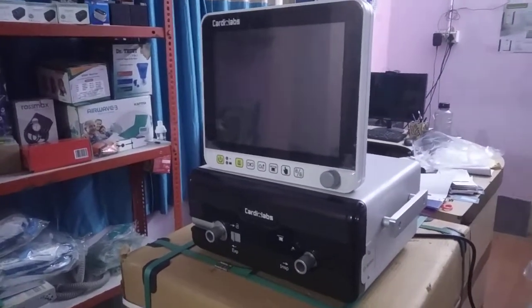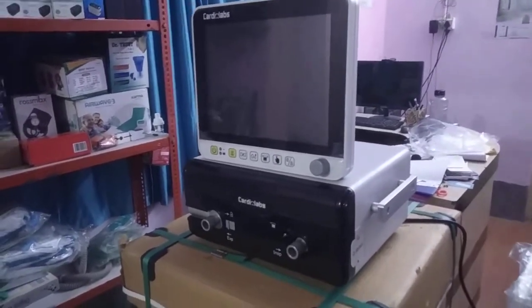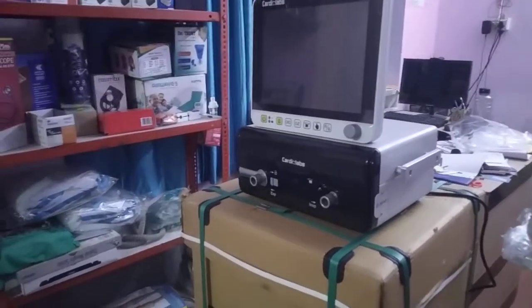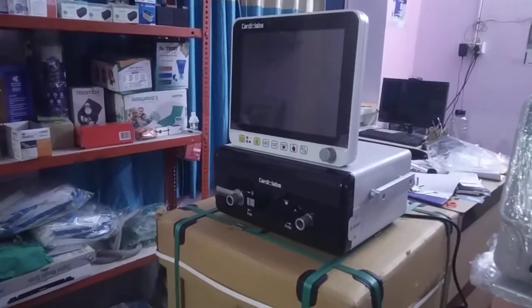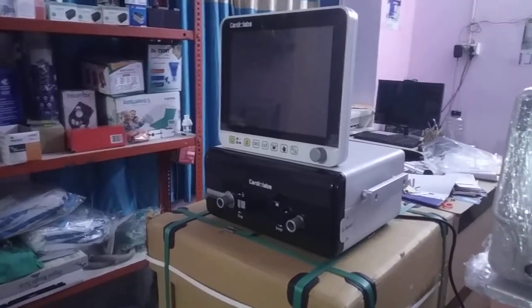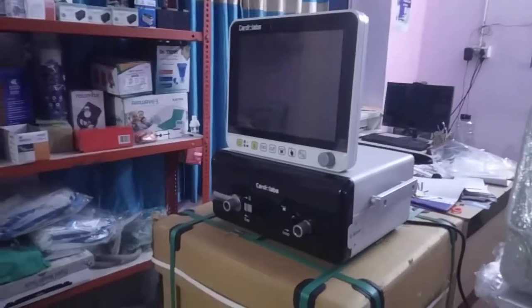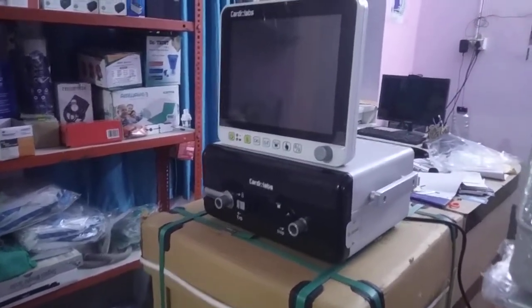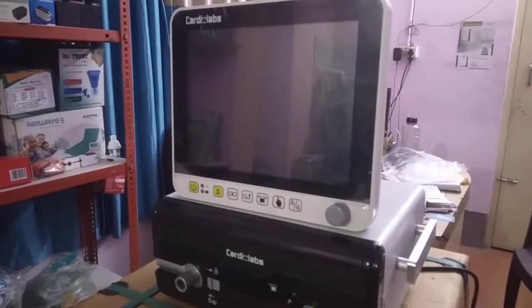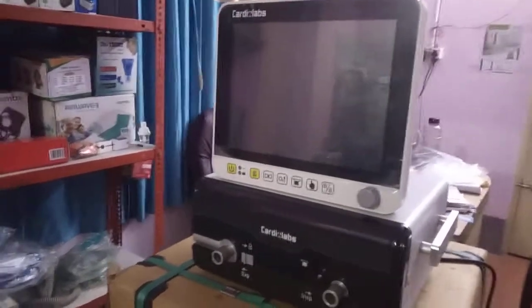Whenever US or German companies make ventilators, their own country people buy them first, which allows them to sell in high quantities domestically and produce more at lower cost, then sell worldwide. I believe the Cardio Lab C Vent 1200T is as good as any US or German ventilator — it has all the modern features found in those machines.